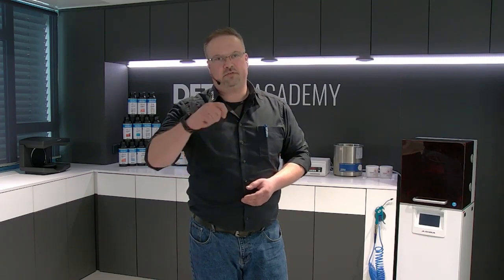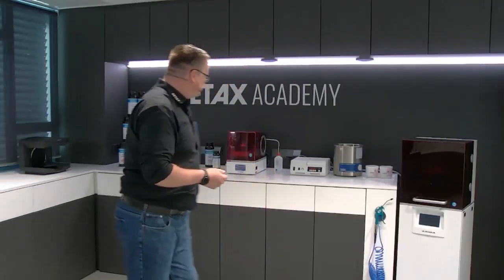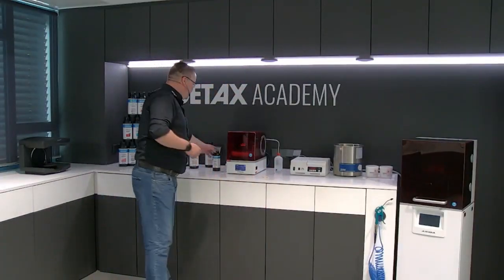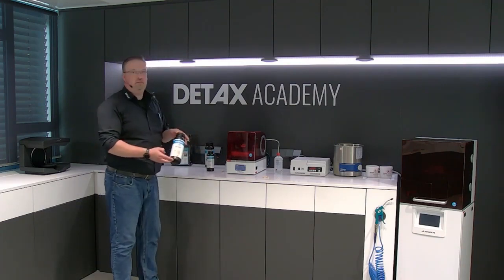There's one more question about the price. I can say if you use a plastic card to take the rest of the material from the platform away, what I showed you before, the rest of the material, the support structure, and the crown inside, all of this is about €1 later. So that means you can prepare a crown for only €1. I think it is a good price, and you can buy 500 grams per bottle, or 1 kilogram is also possible.